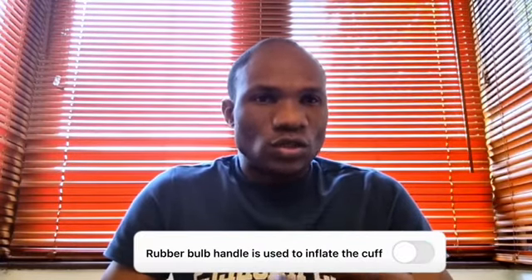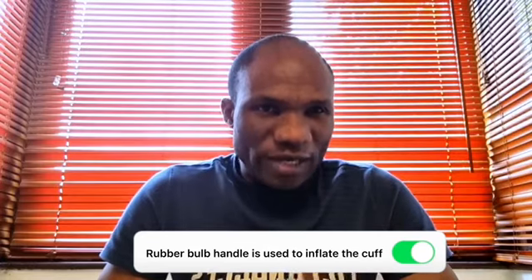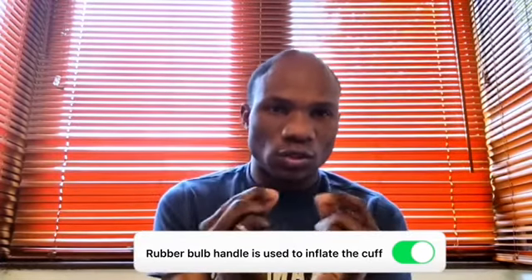Now, this rubber bulb handle is used to inflate the cuff. So when you measure the cuff pressure and you discover that the pressure is low, you can use that rubber bulb handle to inflate it to the desired pressure that you want.